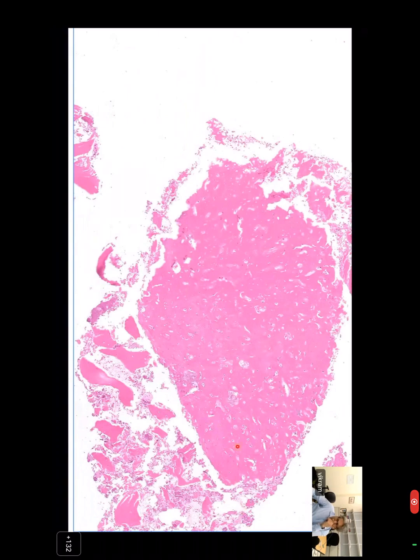In this image, I think this is basically a focus of nidus because it was very well circumscribed and it had the interlinking of the woven bone, but with a lot of mineralization. So I thought this is a nidus with the periphery having the normal laminated bone. There's extensive bone deposition, almost forming a sheet-like appearance, right? It's not the usual appearance for an osteoid osteoma, but occasionally you see the sheet-like osteoid deposition.